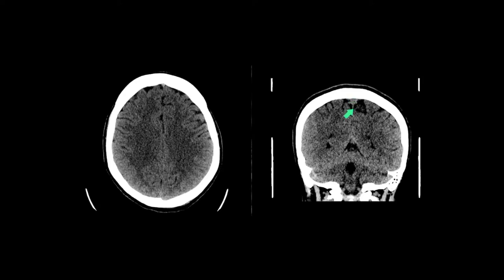You can see on the coronal slice that this is the falx cerebri. It splits into a right tentorial leaflet and a left tentorial leaflet. As a result of these meningeal reflections you are left with an infratentorial brain and a supratentorial brain. The falx divides the supratentorial brain into the left cerebral hemisphere and the right cerebral hemisphere. The infratentorial brain comprises the left cerebellar hemisphere, right cerebellar hemisphere and brainstem.